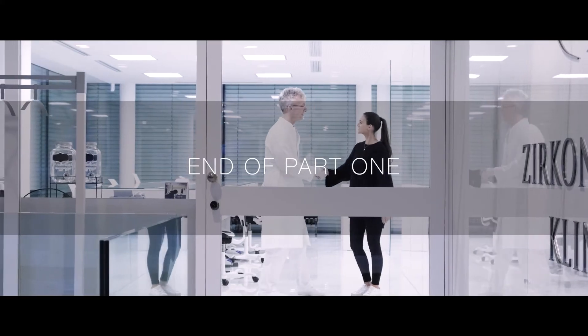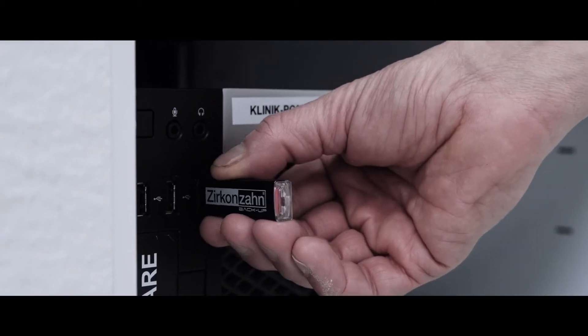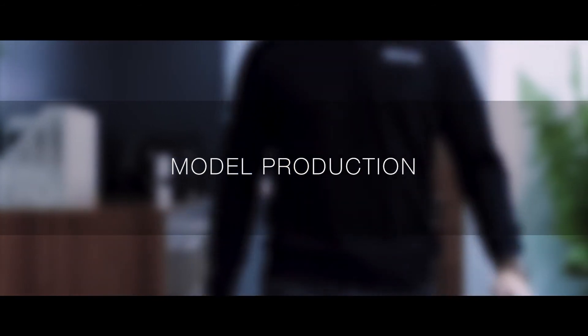At this point, the registration process of patient data is completed. The doctor collects all the data acquired and delivers them to the dental technicians. In the laboratory, we take care of the organization of all data. Using Zirconzon's software package, we prepare the bases for the digital design of the restoration.